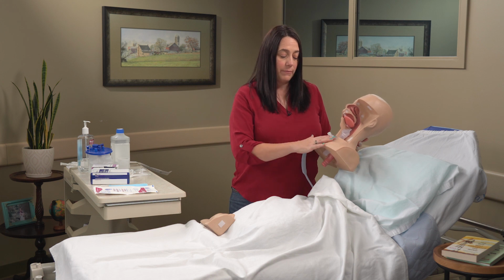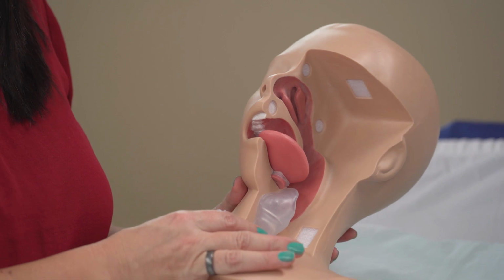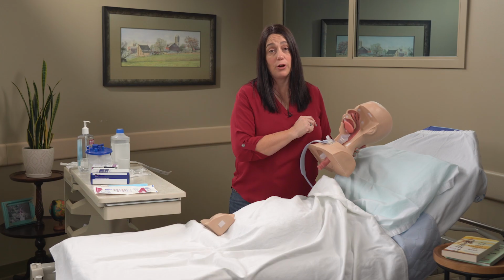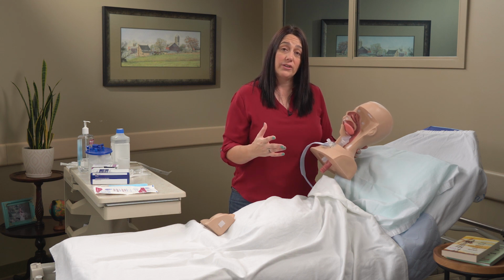Some of the other risks for this person are that because they're not breathing in through their nose, they can have more bacteria that can get directly into their airway. So they are more at risk for respiratory infections than other people. Once again, minimize movement or touching of the site. Try not to be bumping that when you're helping that person with cares. Encourage them to cough throughout their day. If you see any signs that they're having trouble clearing any mucus out on their own, get a hold of the nurse.